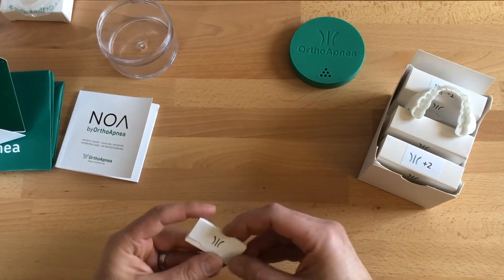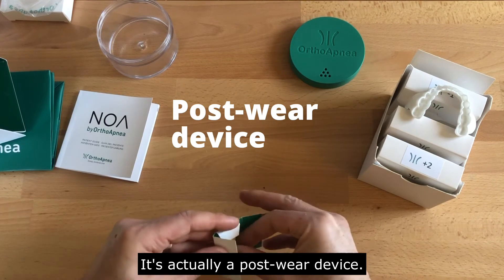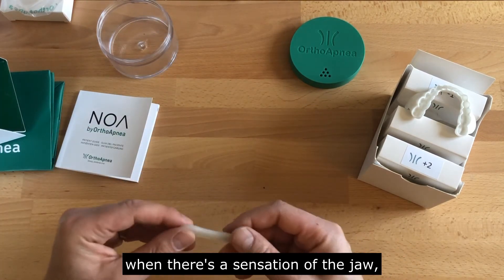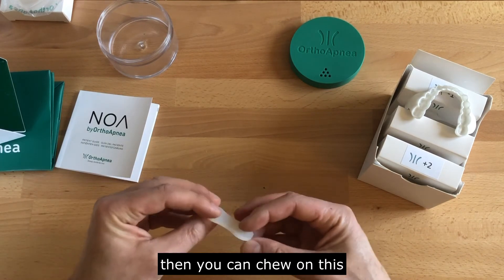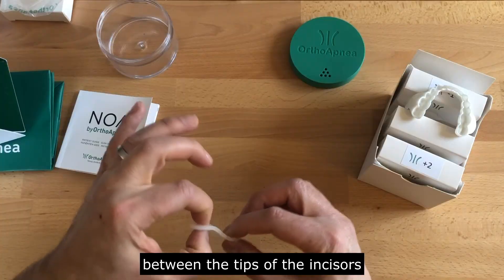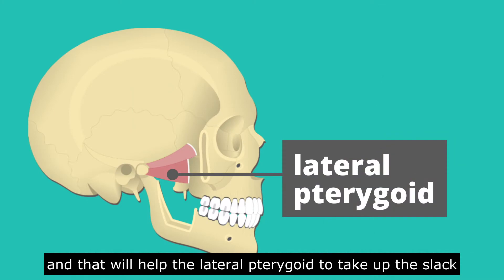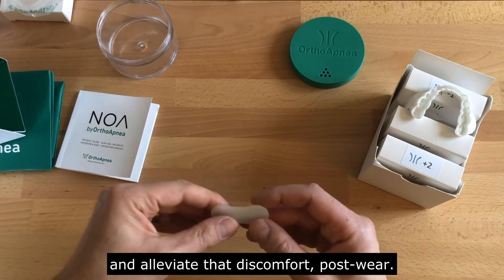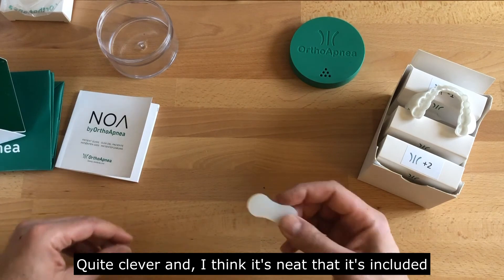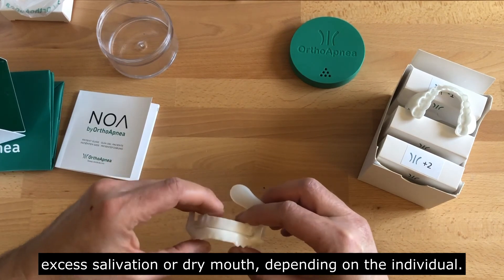Now, I touched on this — you might think, what's this, a box of matches? No, it's actually a post-wear device. The first thing in the morning, when there's a sensation of the jaw not quite returning to the correct position and there's a little discomfort in the TMJ, you can chew on this between the tips of the incisors in the shower — a bit of heat, humidity, and some motion. That will help the lateral pterygoid to take up the slack and help disperse the fluid around the condylar head and alleviate that discomfort post-wear. It's neat that it's included, because that's one of the most common side effects, other than excess salivation or dry mouth depending on the individual.